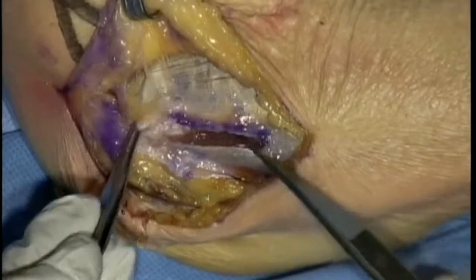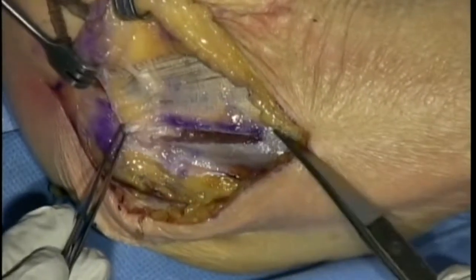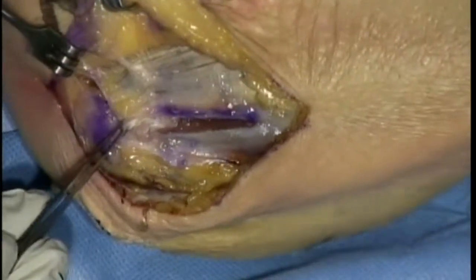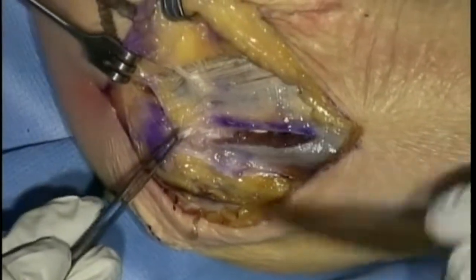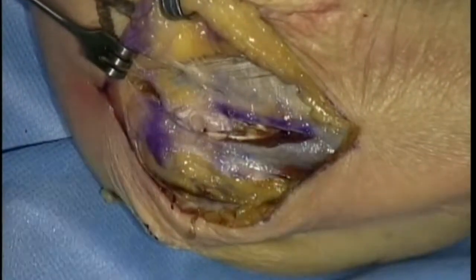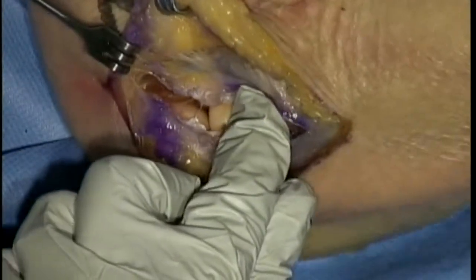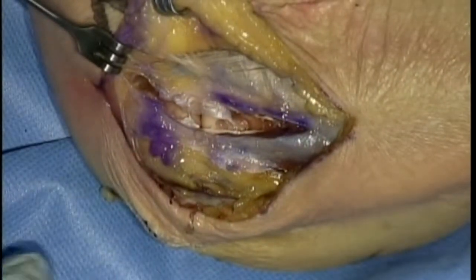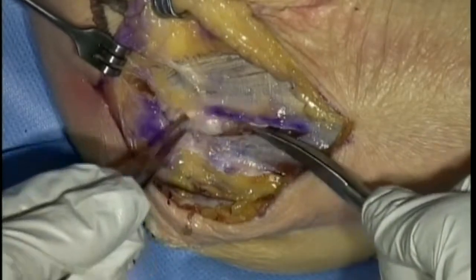So that's going right through, there's a nice white raphe in the extensor carpi radialis longus. It's quite dense, and it runs right about there, and basically it's centered right over the radial head. What I'll often do is feel the epicondyle, then feel the radial head, and go pretty much right in the middle of the radial head. And you can see it there. The incision is made directly, basically, to bone, across and down.